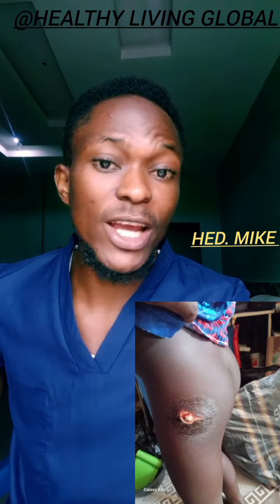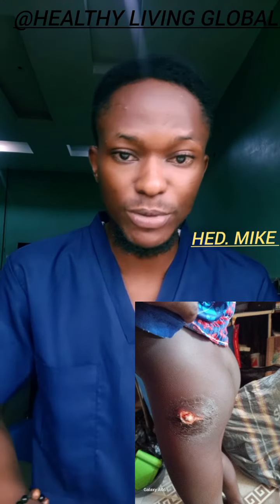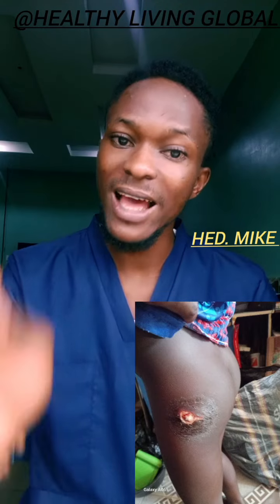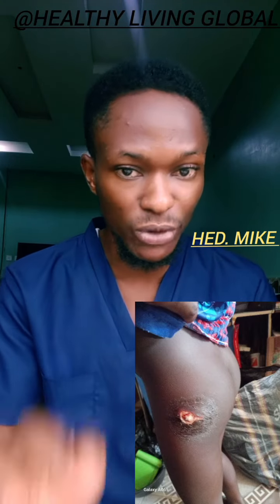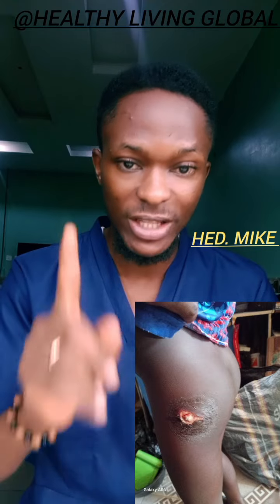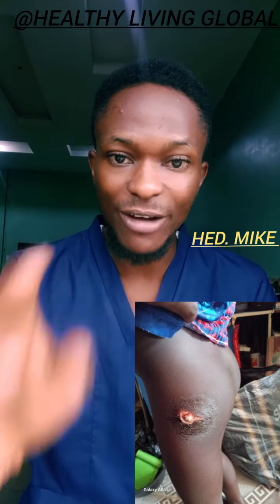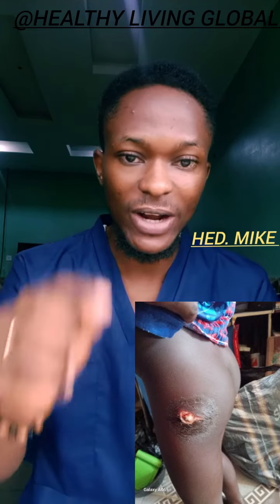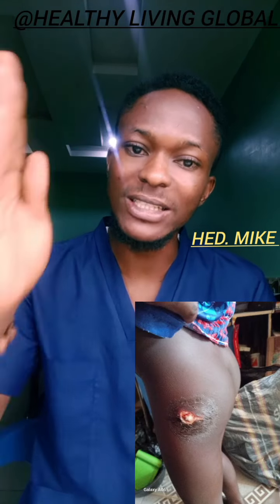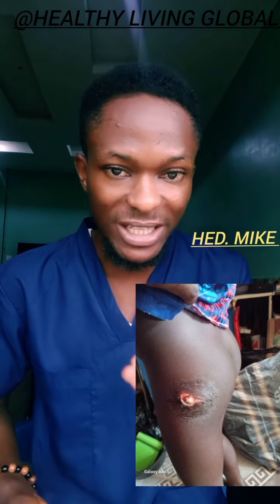Please note, this is for educational purpose. This procedure may vary in different hospitals, but to avoid abscess, follow this procedure. After following this procedure, you can be 100% sure, or 99.9% sure, that you are going to avoid injection abscess. Alright, let us go. What we are talking about is how to give IM injection to avoid something like this.